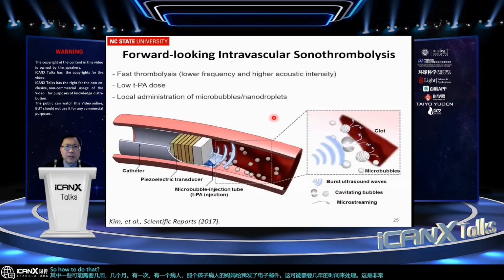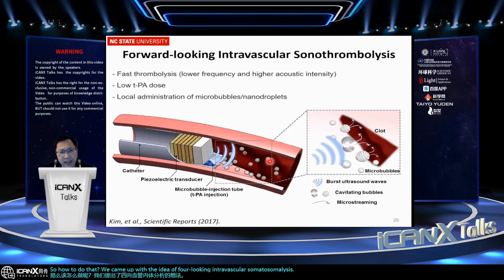We came up with the idea we call forward-looking intravascular sonothrombolysis. Our idea is if you have a blood clot here, we want to bring the microbubbles here and then use ultrasound to cause cavitation to disrupt this blood clot more effectively. Right. So that's really inspired by some of the work we know.